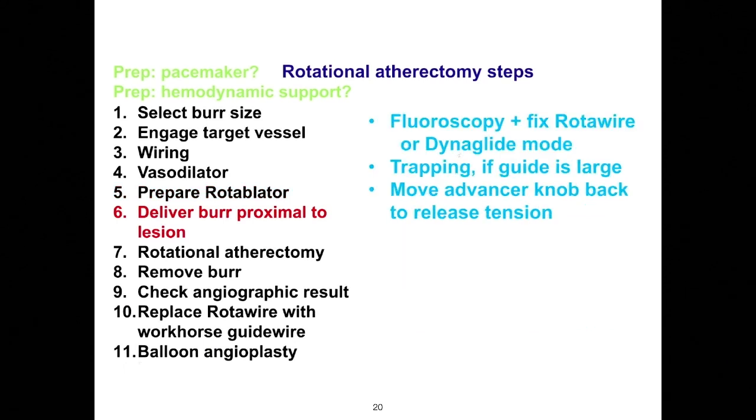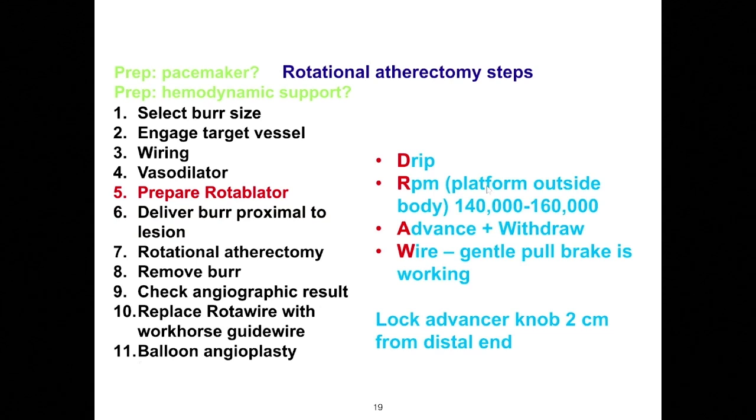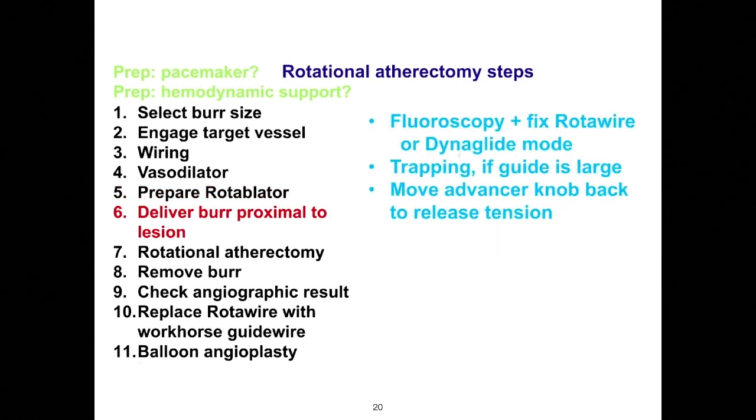And one more thing you have to do is to lock the advancer knob at least 2 centimeters from the distal end. The reason for this is that after you've taken the rotablation inside, you push it back so that you remove the slack in the rota wire. And that is important for you to know, that you lock the knob before you take it in at least 2 centimeters from the distal end of the wire.